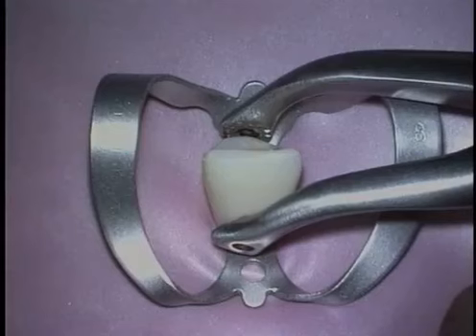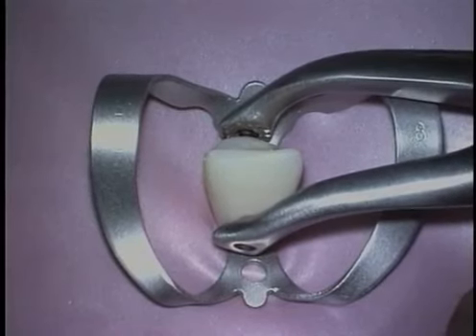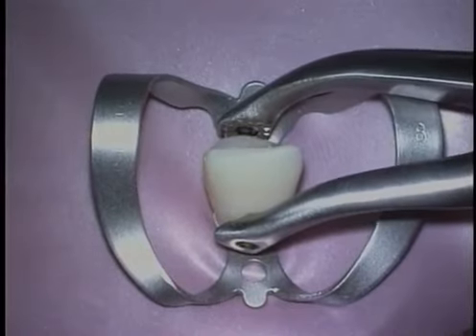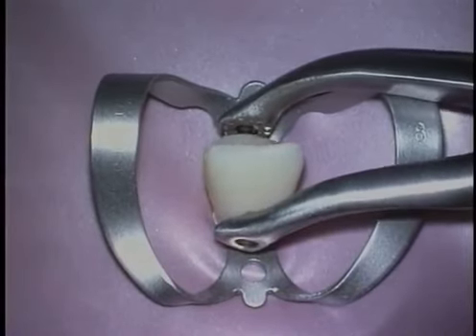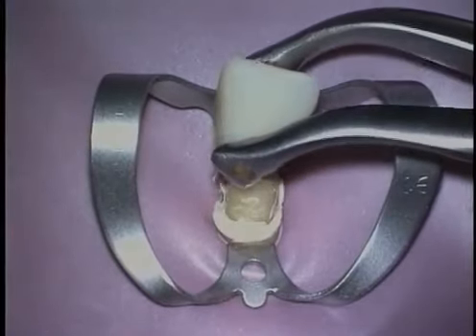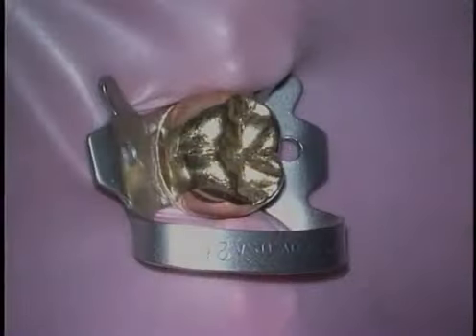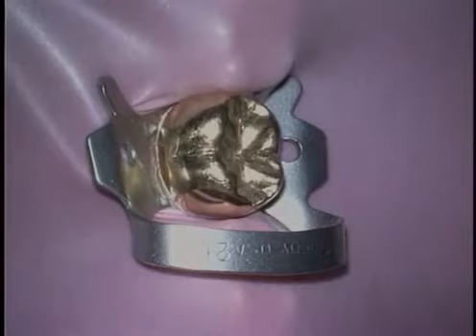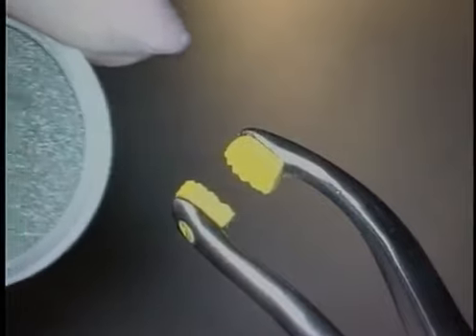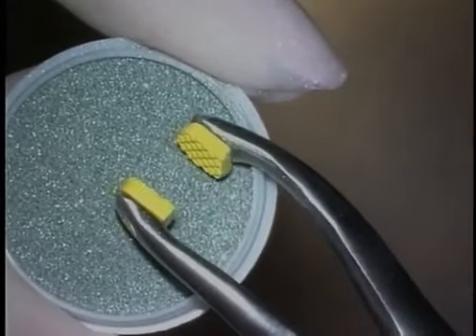Small facial-lingual micro movements facilitate the safe removal, and care should be taken not to apply too much pressure to the handles of the plier, as the provisionalized resin crown can be damaged during the removal effort. For removal of cast crowns or tooth-colored restoratives, rubber packings are inserted on the compressive jaws of the instrument to protect the surface of the crown.